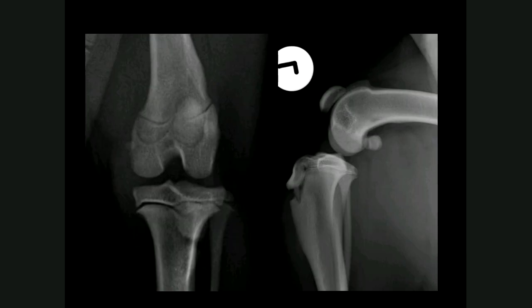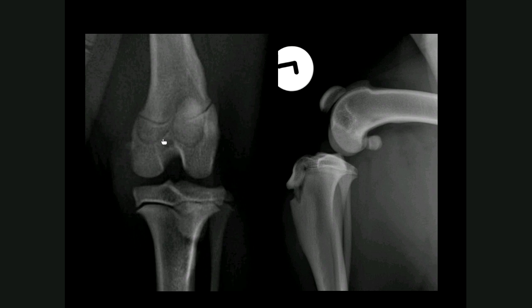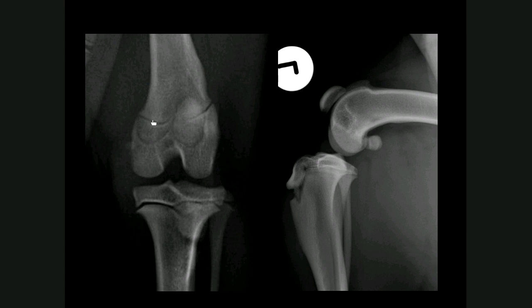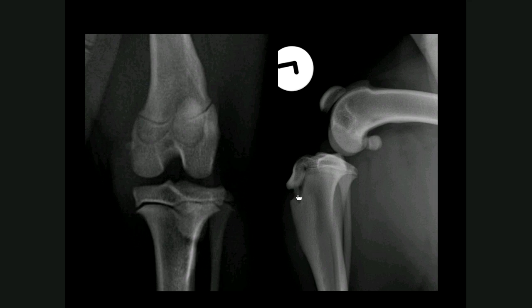In the immature patient, there are ossification centres for the distal femur with its physis, as well as the proximal tibia with its physis, and the tibial tuberosity with its physis. On the craniocaudal view, the distal femoral physis appears to have multiple lines because the physis is not flat but rather undulating — we are just seeing different levels of the same physis. Also note that the tibial tuberosity has an irregular appearance. If in doubt about whether this is normal, you can take radiographs of the opposite limb, providing it is normal, or refer to a textbook.